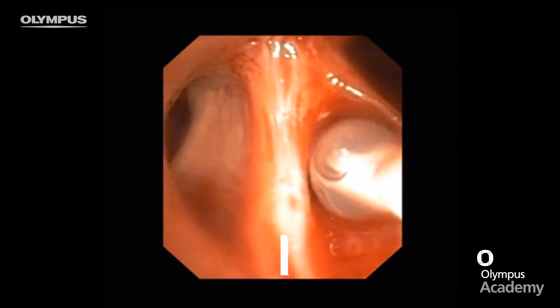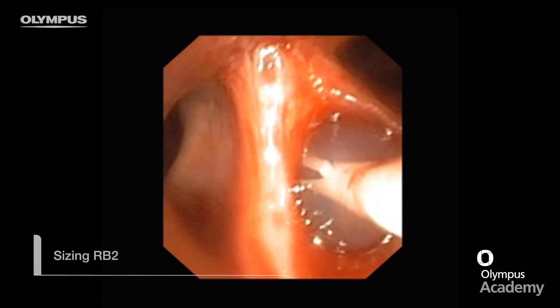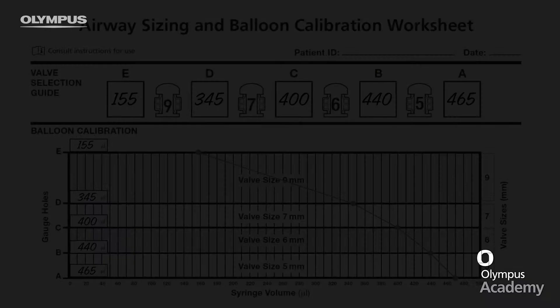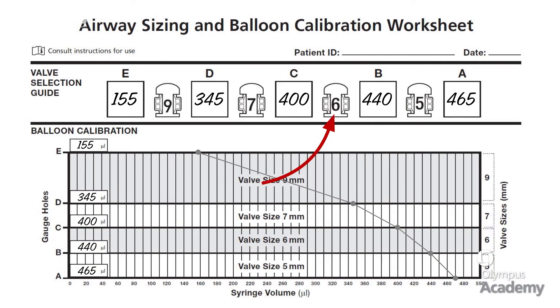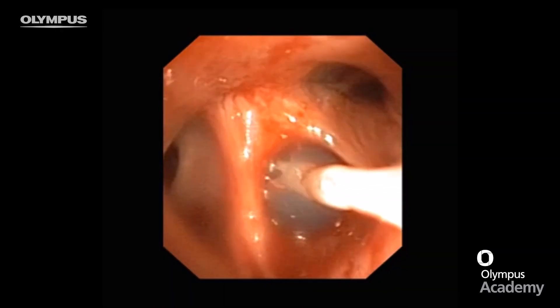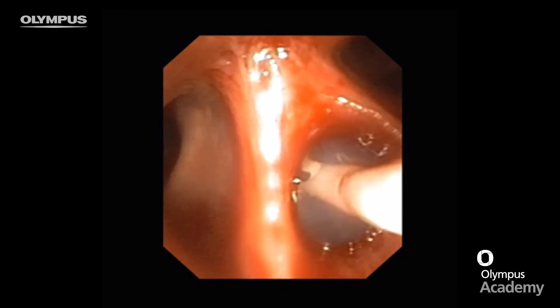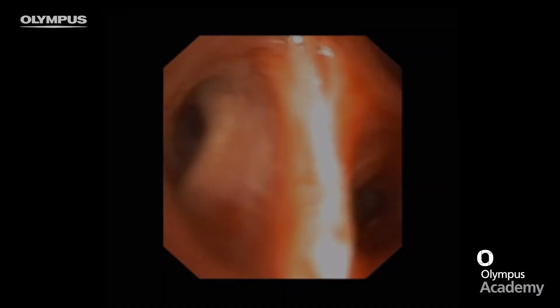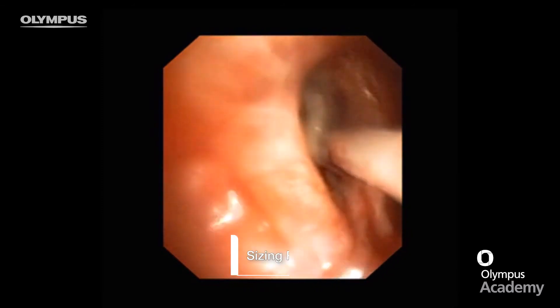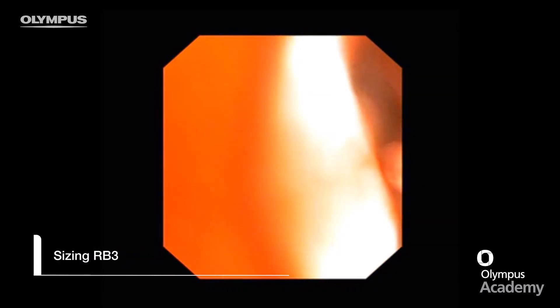I then measure RB2, which looks a little smaller, so I inflate the balloon to the upper limit of a size 6 valve, which is 400 microlitres — this fits perfectly. Next I measure segment RB3 and determine this to be a size 7 airway.